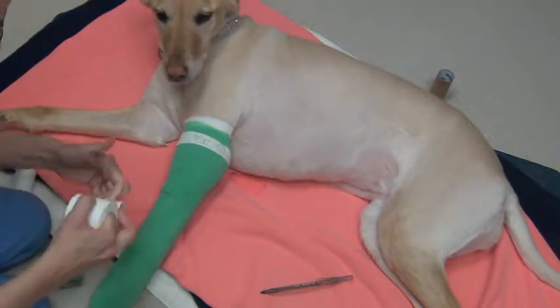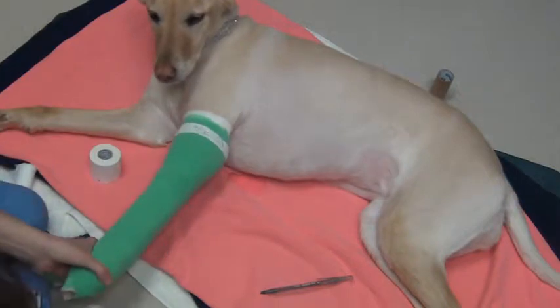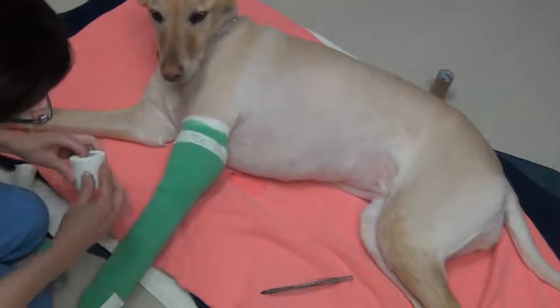And Dr. Jody did use some duct tape. I'm going to go ahead and use some waterproof tape and place that piece down here. And place another piece.